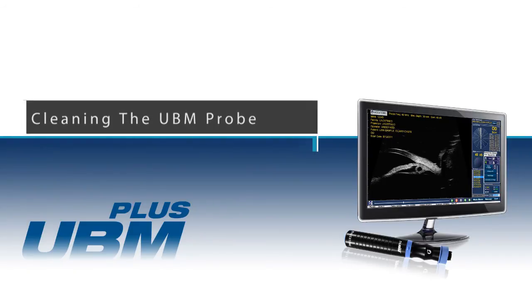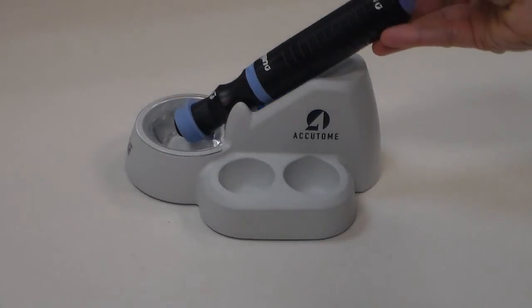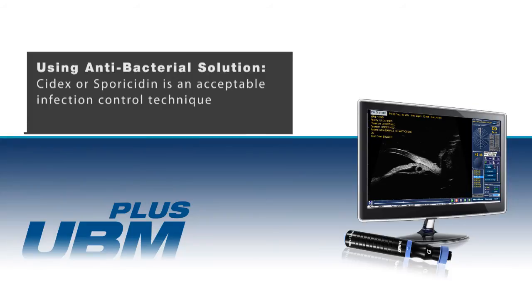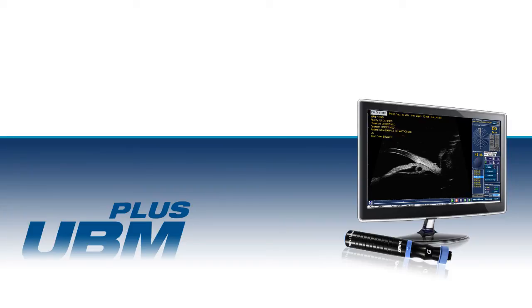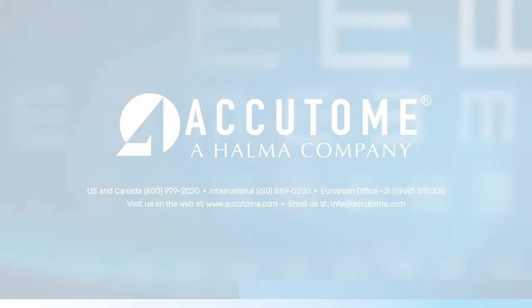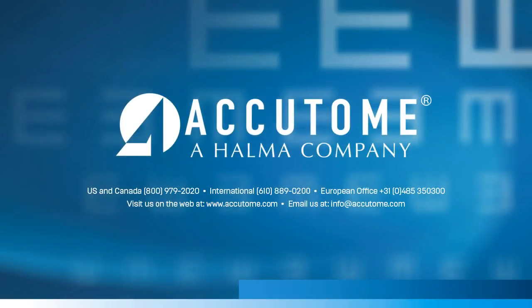Cleaning: clean the UBM probe by soaking only the tip with alcohol. If a higher level of disinfection is required, an antibacterial solution such as Cidex or Sporicidin is an acceptable infection control technique. The immersion shell can be fully submerged in alcohol, Cidex, or Sporicidin. Do not autoclave. Please feel free to contact your Accutome representative regarding any questions or to purchase any of the necessary supplies to complete the UBM examination.